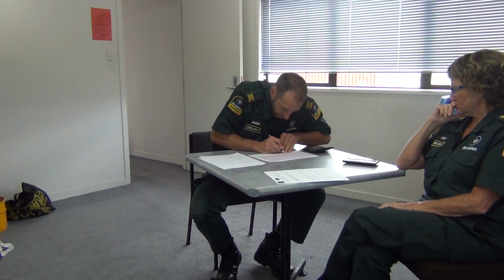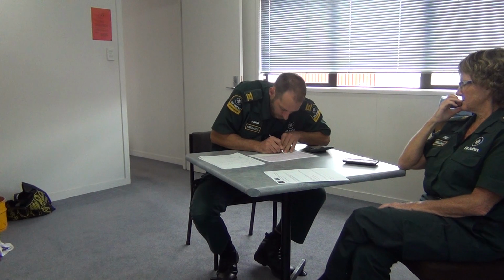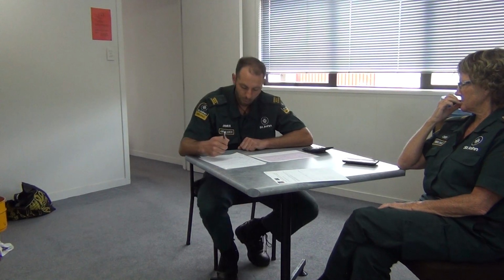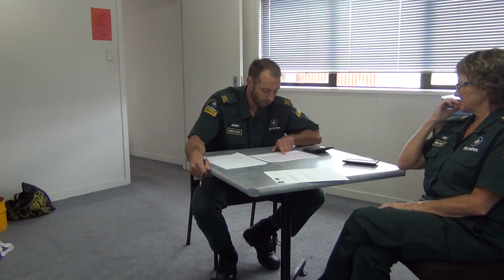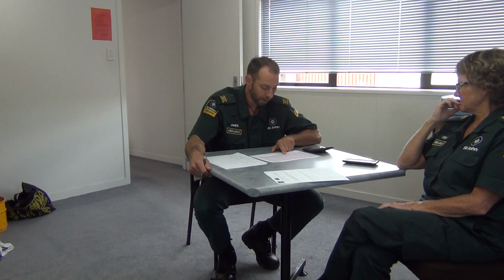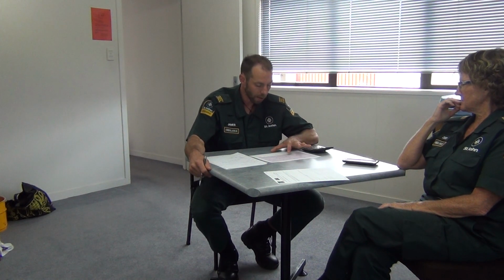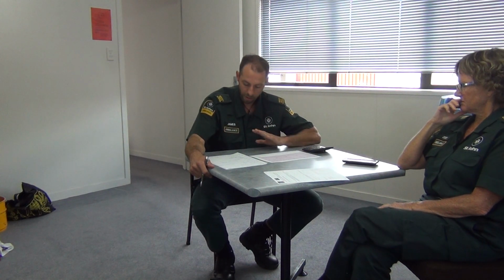Just going to count the squares. 18. Okay, so the QT interval is normal. The way we work that out is we count the squares between the QT, and if it's half of the rate between the RR pattern, then it's normal, which it is.